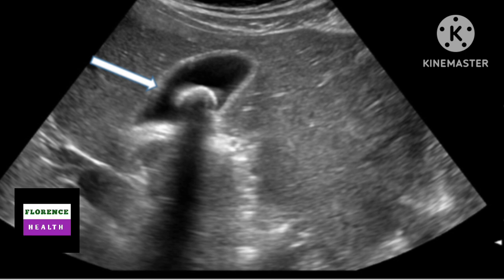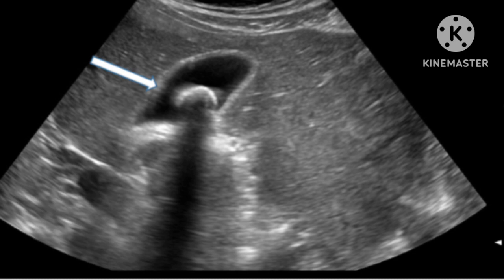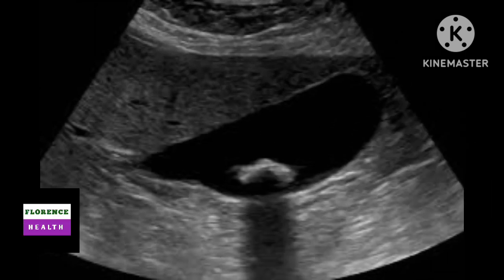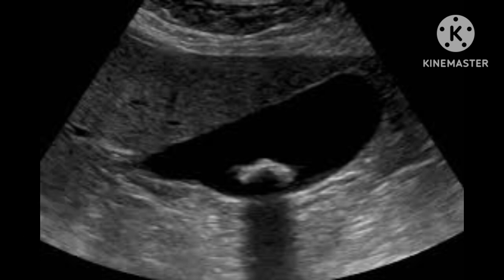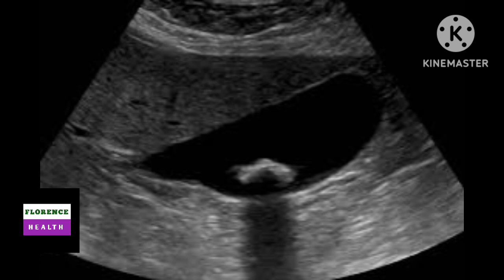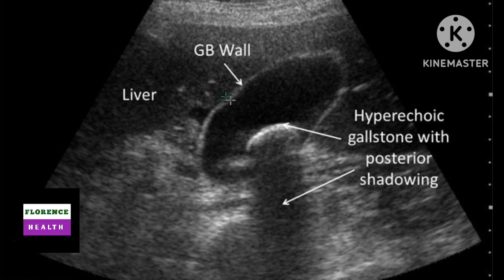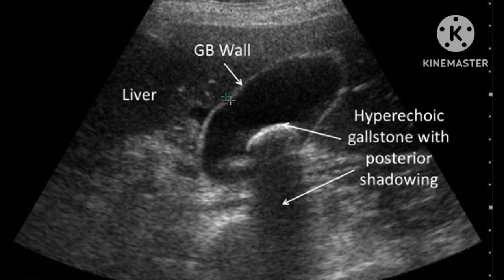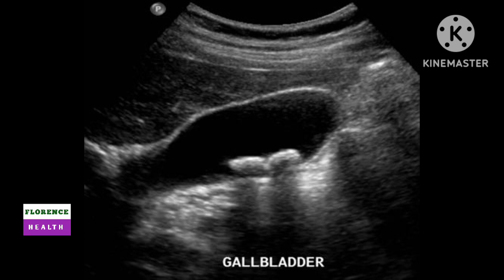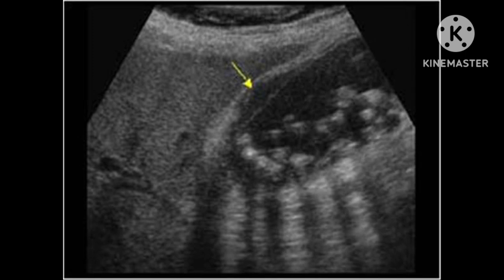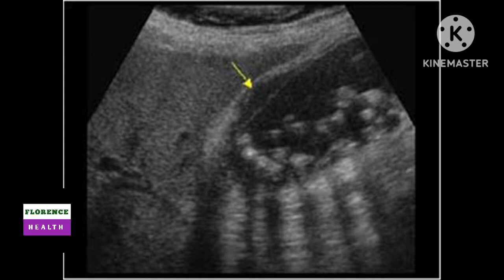This slide shows a single echogenic lesion having a single posterior acoustic shadow due to stone. This slide shows a single posterior acoustic shadow with a single echogenic lesion. This slide again shows a single posterior acoustic shadow with a single echogenic lesion. This slide shows a double echogenic lesion having a double posterior acoustic shadow. This slide shows multiple posterior acoustic shadows with multiple echogenic lesions — that means multiple stones inside.